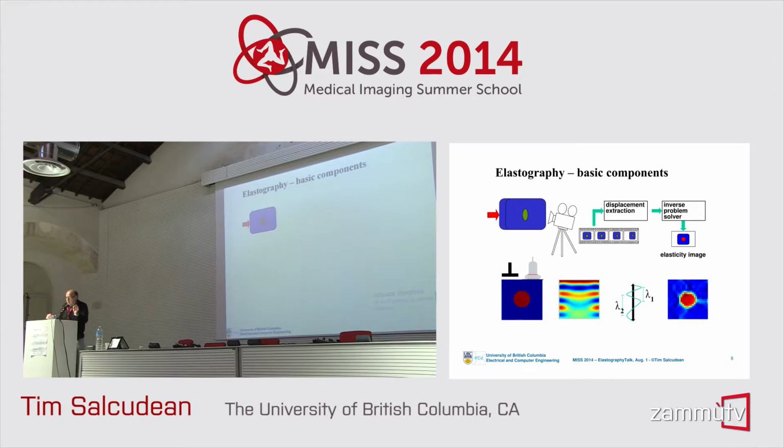So in general, when we talk about elastography, we have several stages of solving the problem. We apply a compression to tissue.